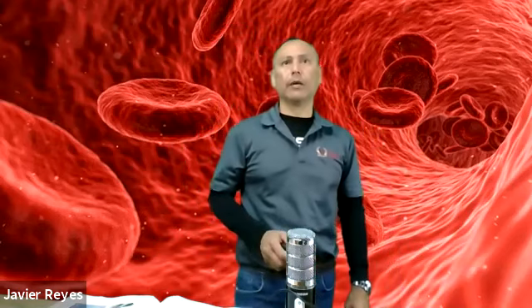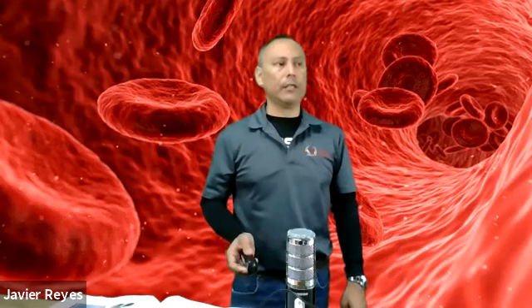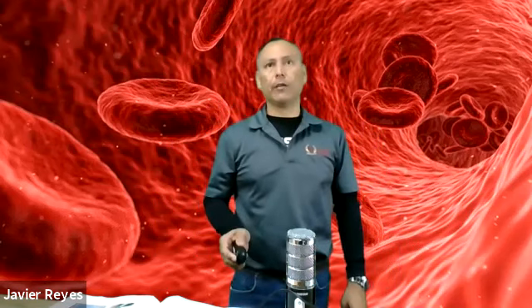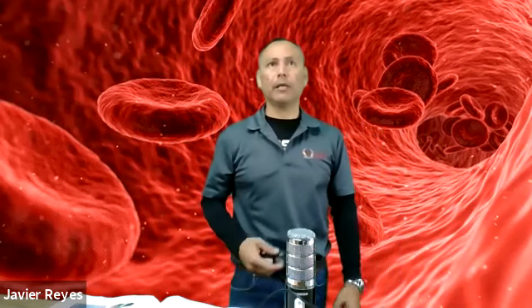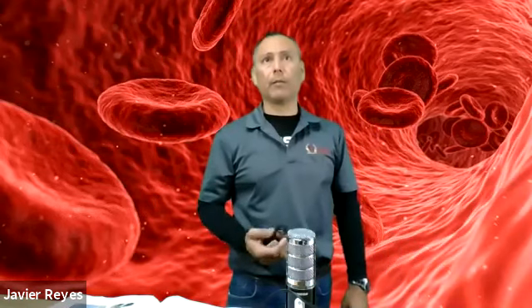Fill and mix any tubes, containers in the order of draw. All right. Again, blood gases, EDTA, other additives, and then finally your serum tubes. Place gauze and apply pressure. Ask the patient to apply pressure, keep the site elevated to minimize the amount of blood that is going to be bleeding or coming out.